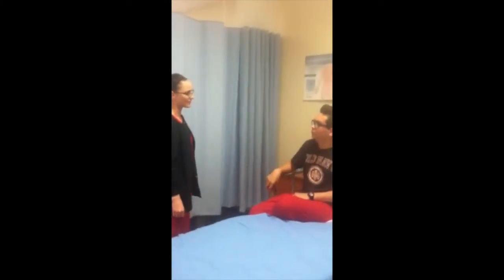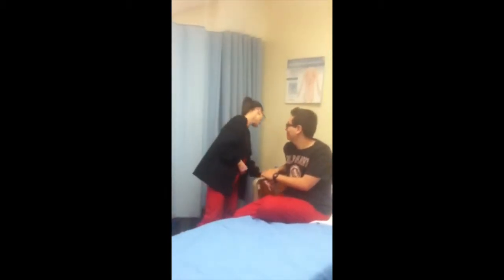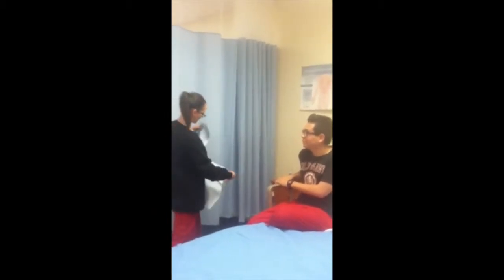What we're going to do is an EKG to monitor the electricity in your heart. I'm going to have you disrobe from the waist up and put this vest on — much like a jacket, keep it open to the front. I'm going to step out and have you do that for me, please.